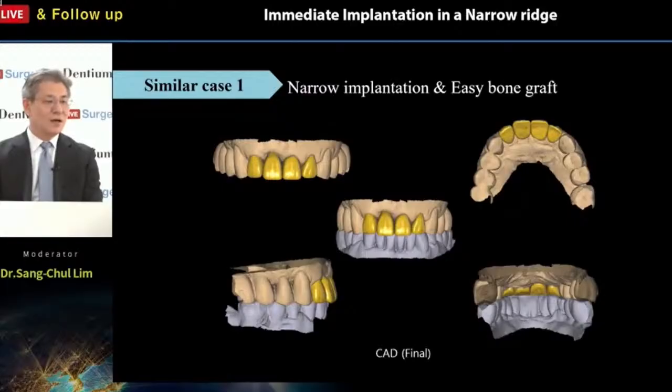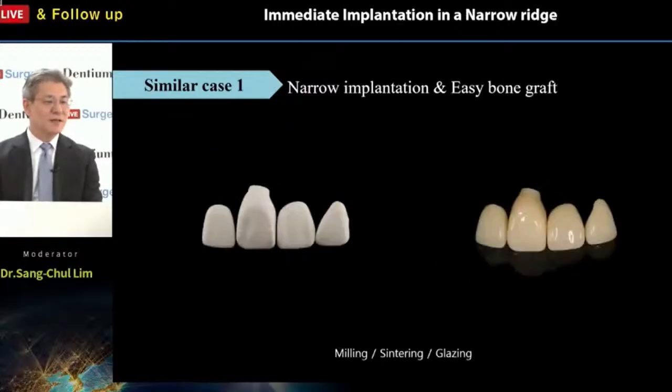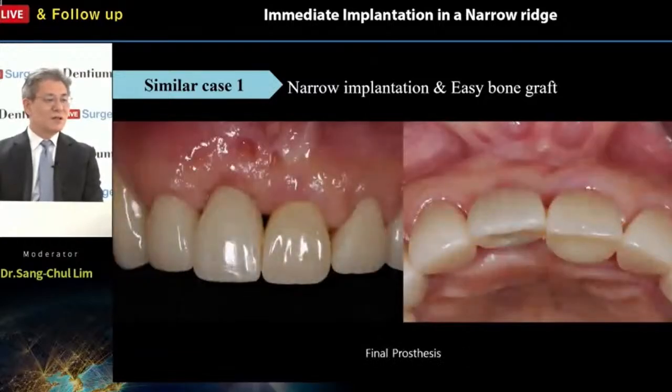Okay, the CAD and the final restoration with zirconia, delivered to our patient. Actually, there is a little bit of recession because of these implant areas. It's very difficult to have an aesthetic outcome compared to the natural neighboring teeth case.